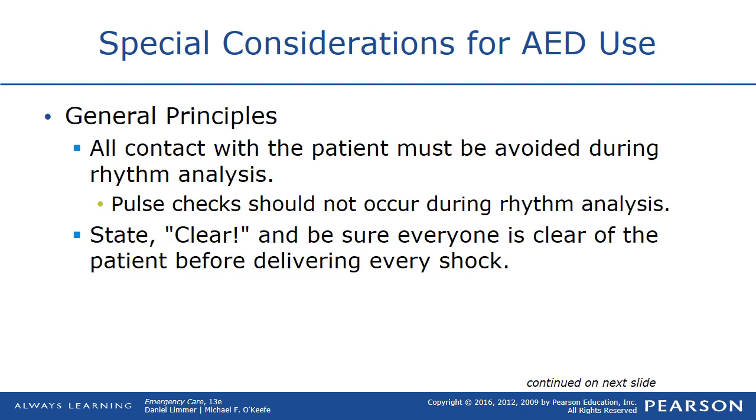All contact with the patient must be avoided while the AED is analyzing. So check rhythms, don't touch the patient. Pulse checks should not occur while the rhythm is being analyzed. When you're getting ready to shock somebody, state "clear" and be sure everyone is clear of the patient before you deliver the shock.